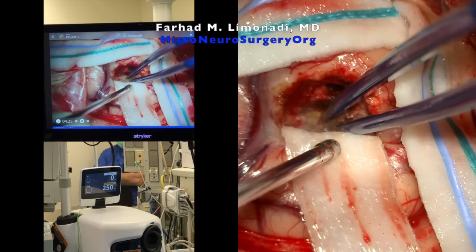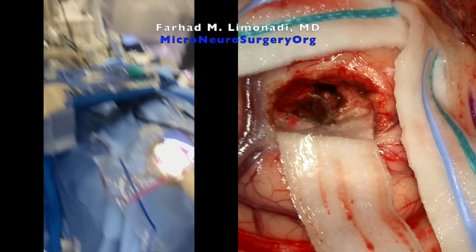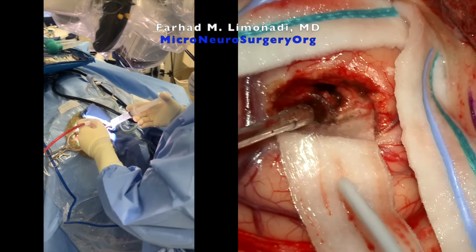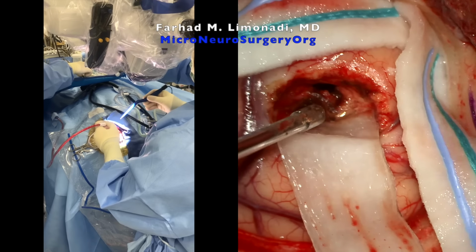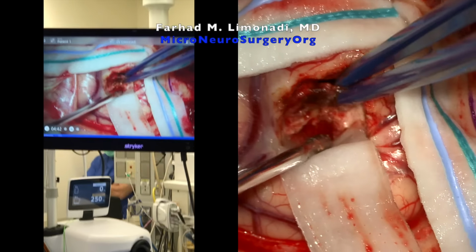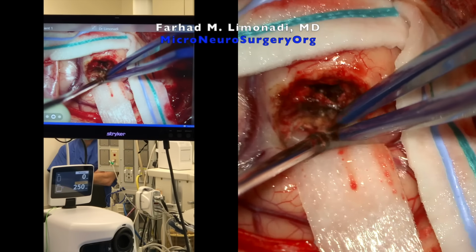and advance the... Can you blend it on off this? Can I see the... Actually, I'll do it. Thank you. It has to be really wet. Okay. And on, please. Hold the capsule. Gently advance this in.